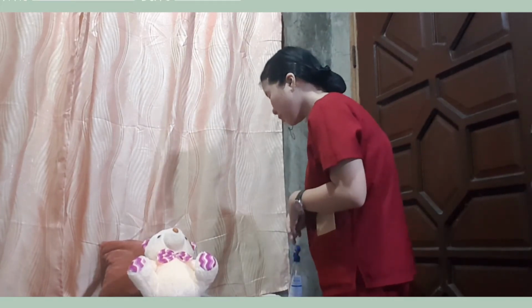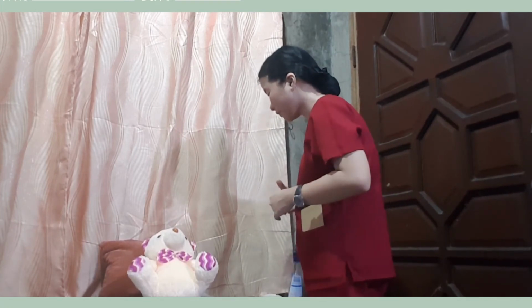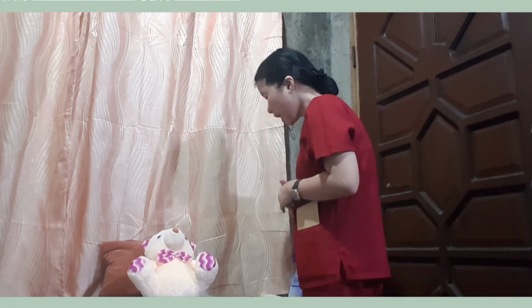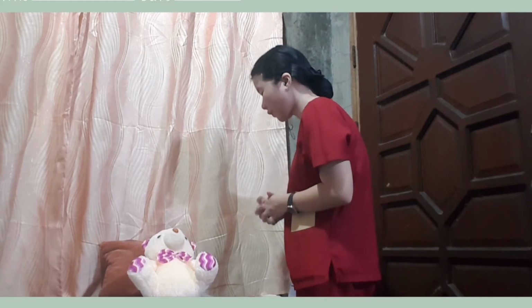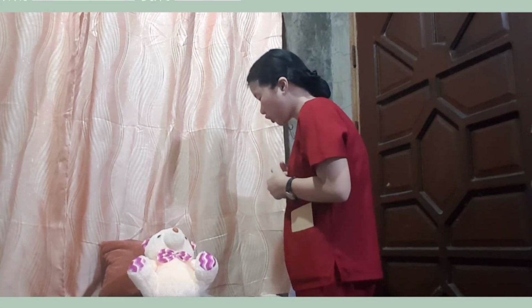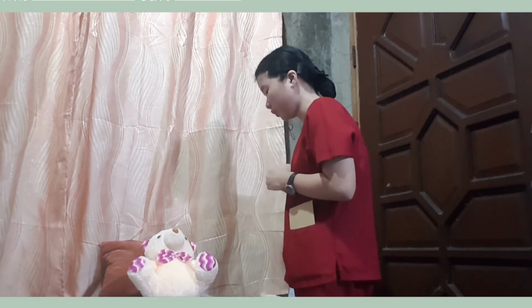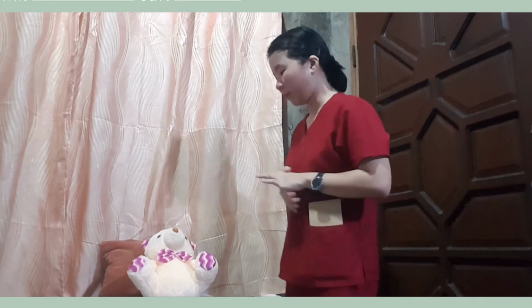So, mag-inject na ko sa imong haog insulin, ma'am. It is used to control blood sugar in people who have type 1 diabetes, a condition in which the body does not make insulin and therefore cannot control the amount of sugar in the blood, or also in people who have type 2 diabetes, a condition in which the blood sugar is too high because the body does not produce or use the insulin po. So, okay lang po? Okay po.